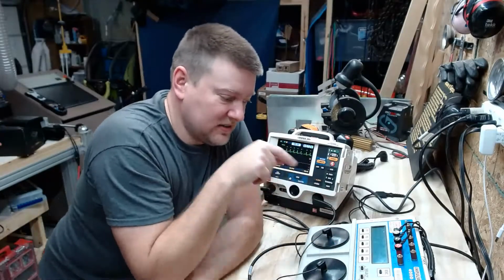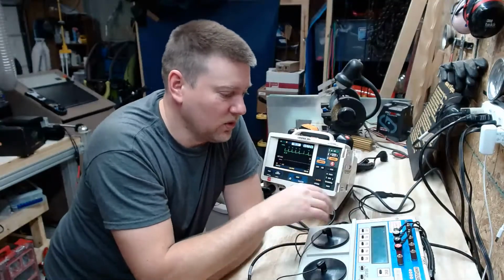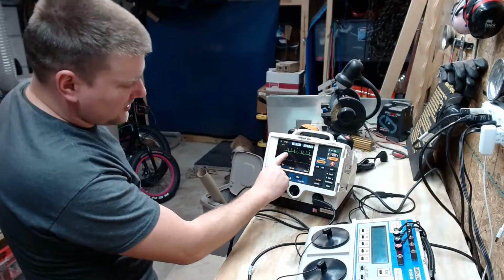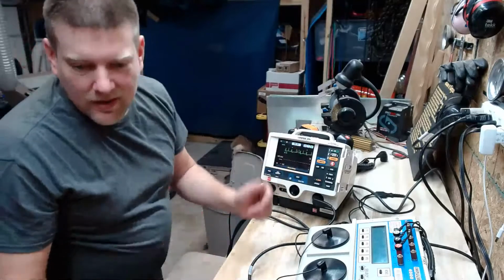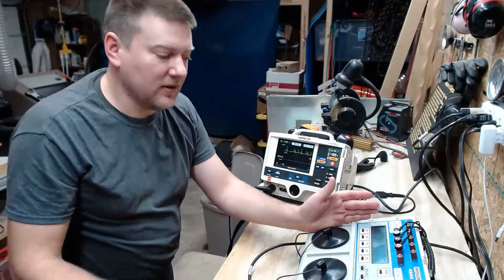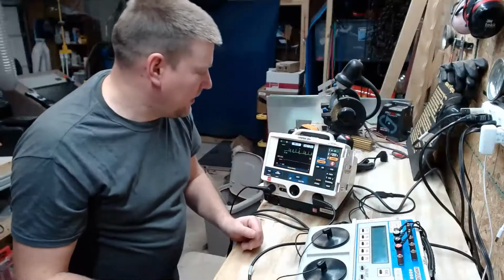So I'm going to come over here to my analyzer and hit the under button, which takes me down to 80 BPM, and you start seeing the pulses. See the pulse? This is the heartbeat. That's the pulse. Heartbeat, pulse. It's demand mode. It's basically saying if you fall below the set level, the defib is going to take over and beat the heart for the patient.